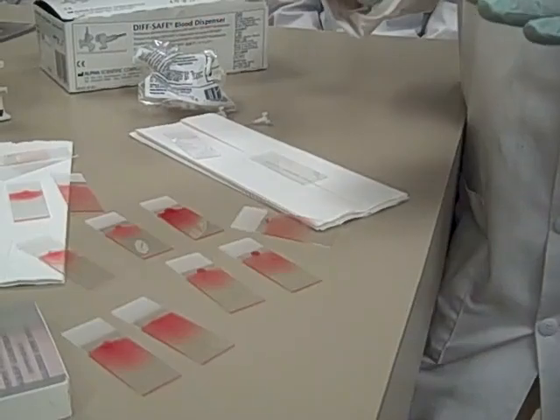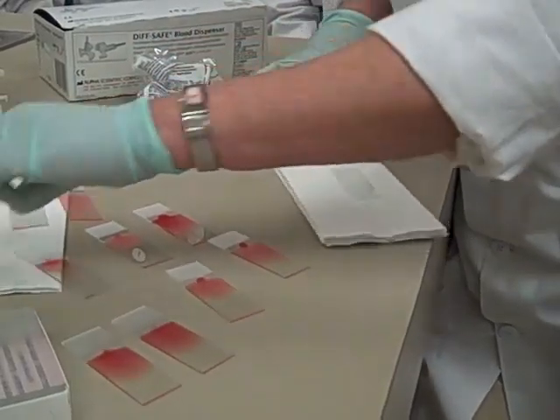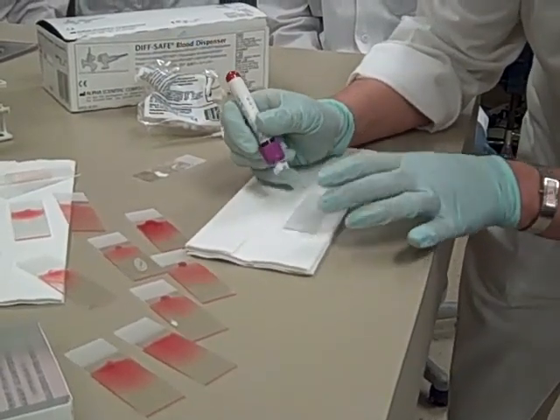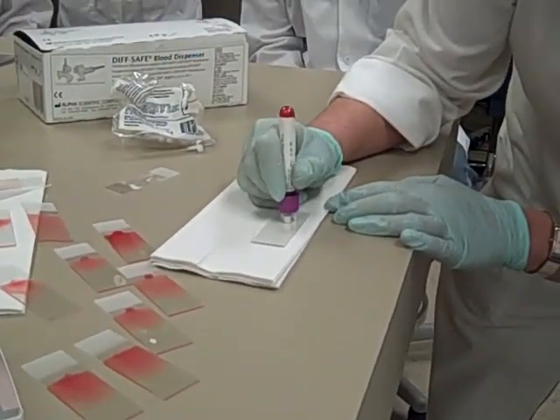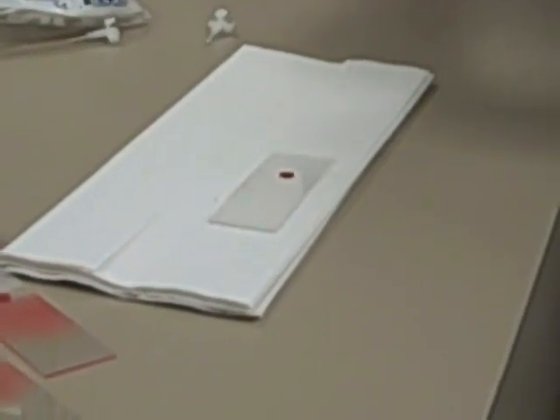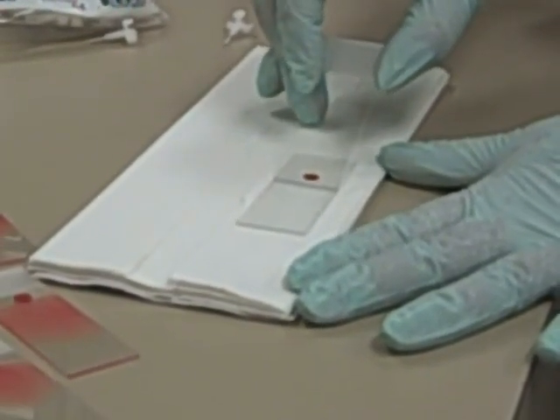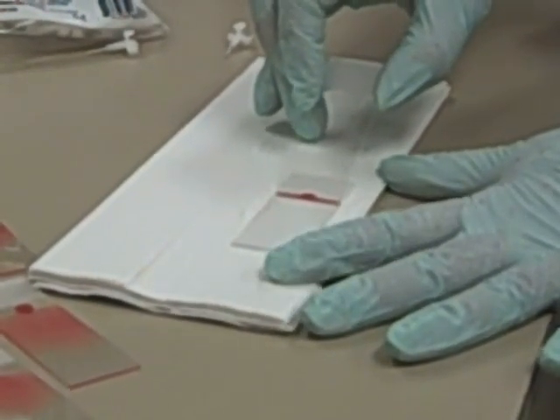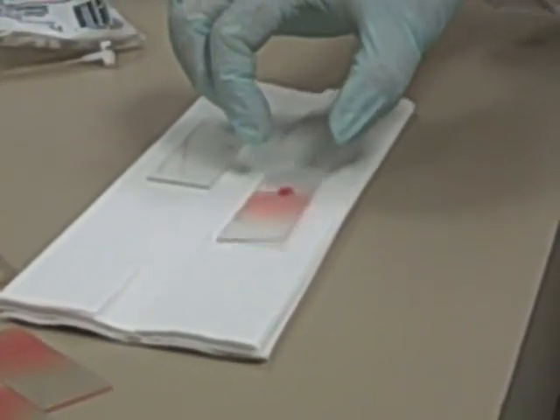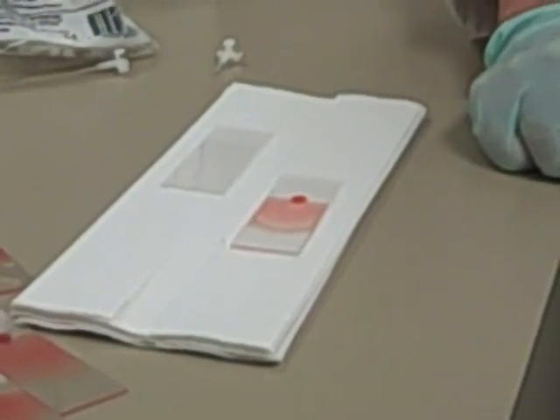I do it one way, but I don't care how you get to the final product as long as the final product is good. Let me show you another technique called the push smear. Leave the slide flat on your paper towel, take your spreader slide, come up at a 45-degree angle, kiss and wiggle, and push. Lauren and I will be walking around making sure you at least have the idea down. Any questions about blood smears today? Alright, we'll get started.